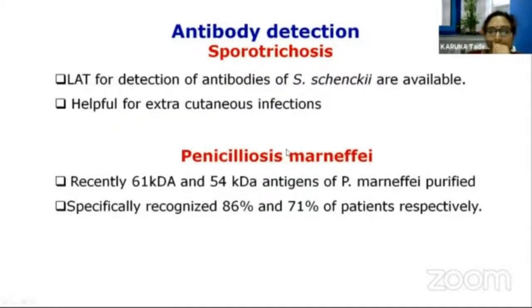Now, sporotrichosis, we also have cases in India with sporotrichosis. The latex agglutination test for detection of antibodies against sporotrichin is available and helpful for extracutaneous infections. Penicilliosis marneffei, so this is Talaromyces marneffei. Over the period of the lecture, we have understood that this has long been changed to Talaromyces. So penicilliosis has been changed to Talaromyces.